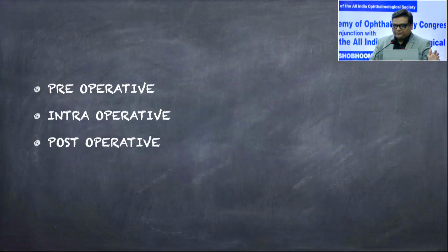So I'll be talking basically on cataract surgery in a case which has undergone vitrectomy. There is no vitreous support. This poses a different set of problems pre-operatively, intraoperatively, and post-operatively. We'll be going through these areas in detail.